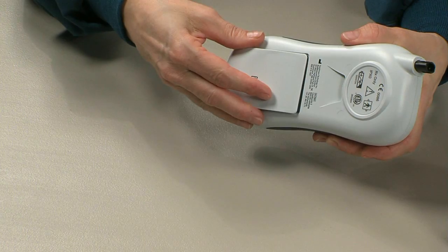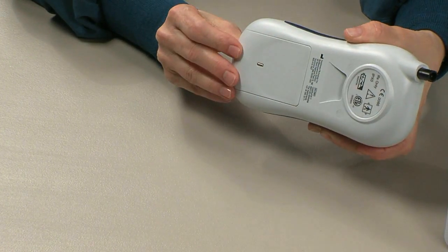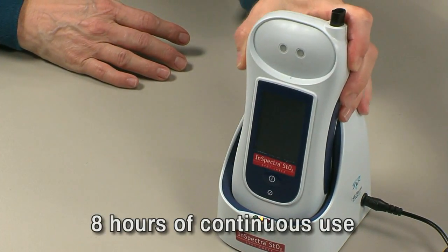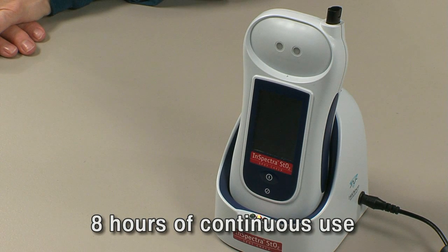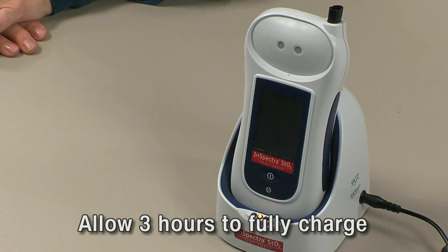The InSpectra STO2 SpotCheck device uses AC or battery power. First, install the rechargeable lithium-ion battery. Place the battery in the back of the device and slide in to engage. When new and fully charged, the battery allows over 8 hours of continuous use. The battery may need to be charged prior to first use. Allow 3 hours to fully charge the battery.